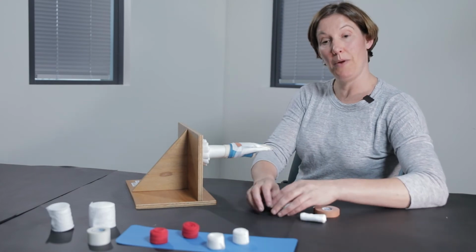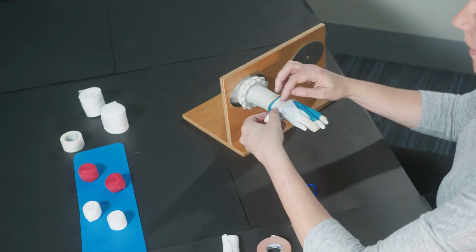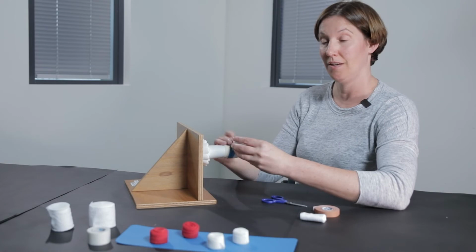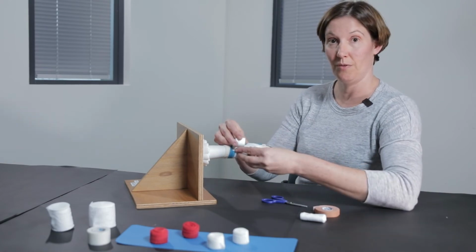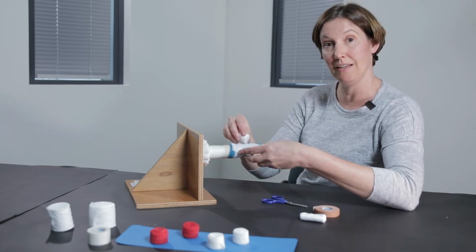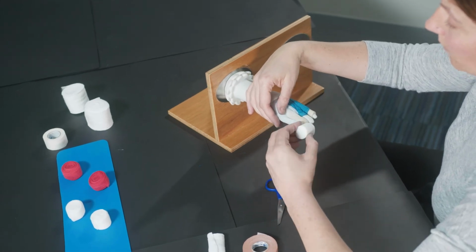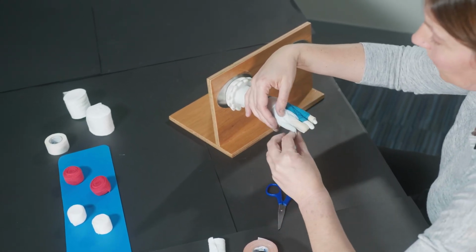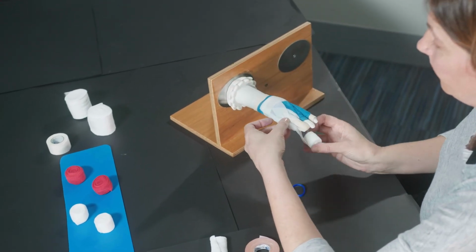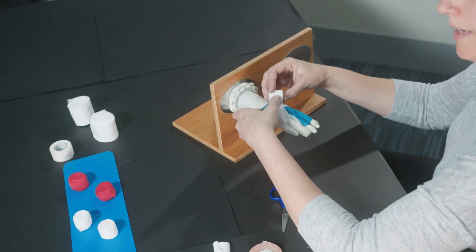And you might get yourself prepared again with your soft wrap and be ready to go again with your next finger. So again, around the wrist, and again, just waiting at the back of the hand in order to do the next finger. Okay, so they might close their hand. It's waiting until they start to relax again and lift that finger up. And again, try and get your soft wrap through that web space as best you can, trying to keep it as flat as possible. Okay, and then back to the wrist. Okay, and again, you may cut and tape.